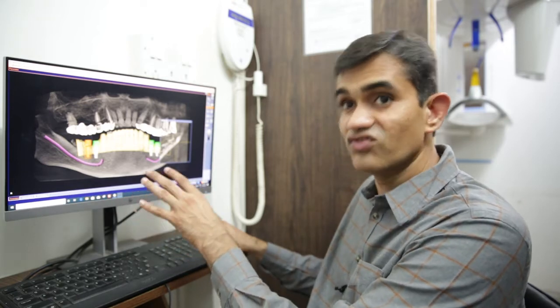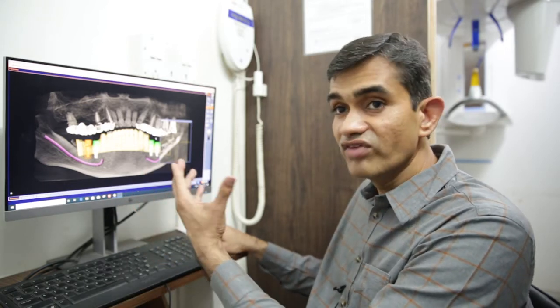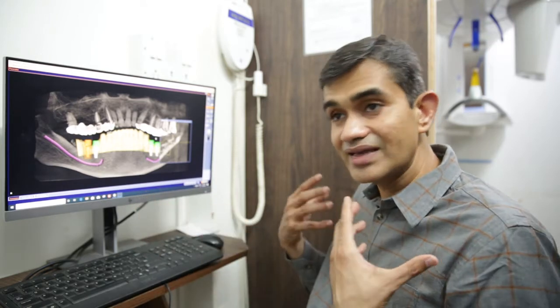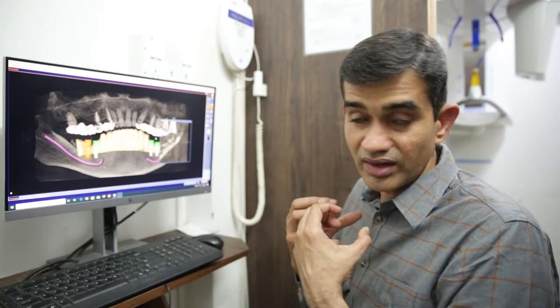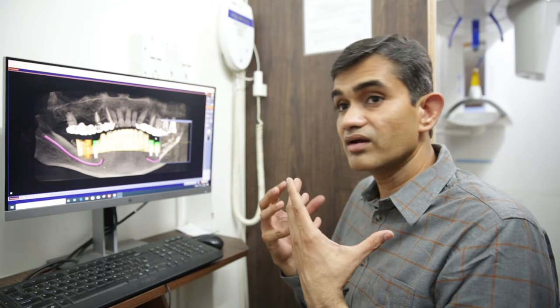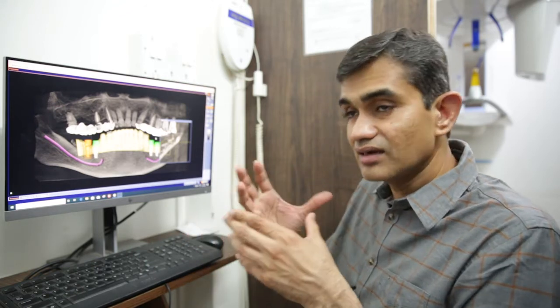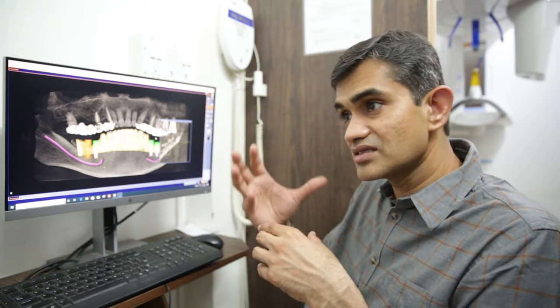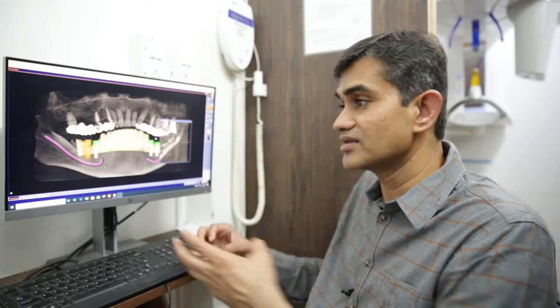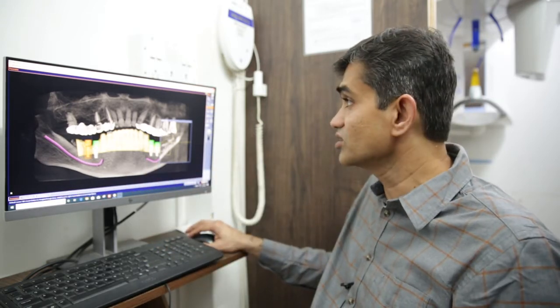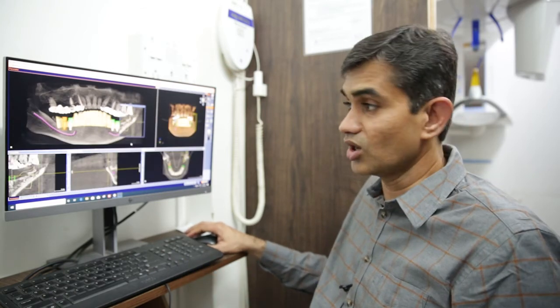We are planning four implants for this particular patient's lower jaw, where there are teeth in the front but no teeth behind. We have integrated the digital scan along with the CT into one unit and are digitally planning the implants. The advantage of this digital workflow is that we know the most ideal position for the teeth, and we plan the implants to achieve that ideal teeth position.